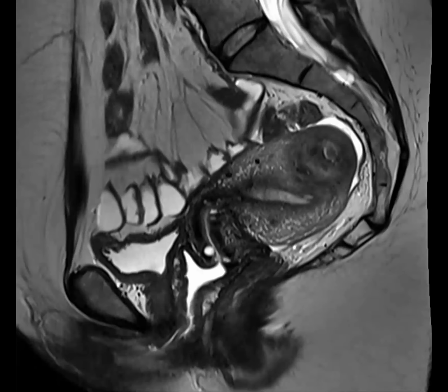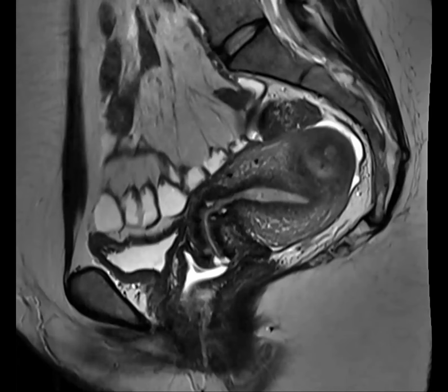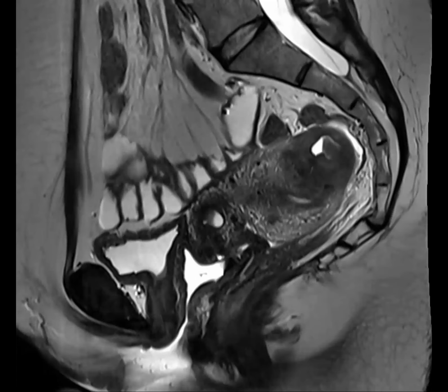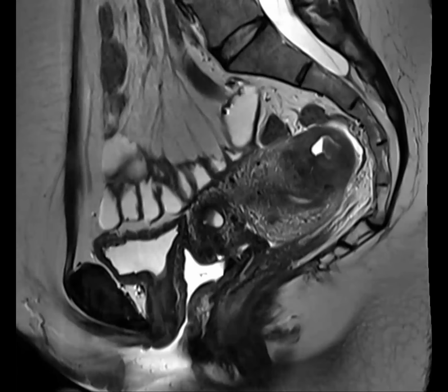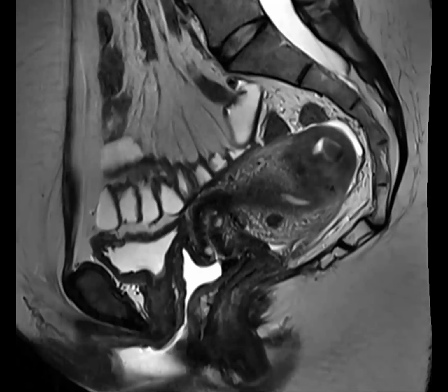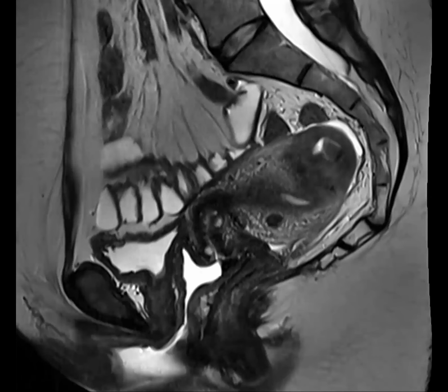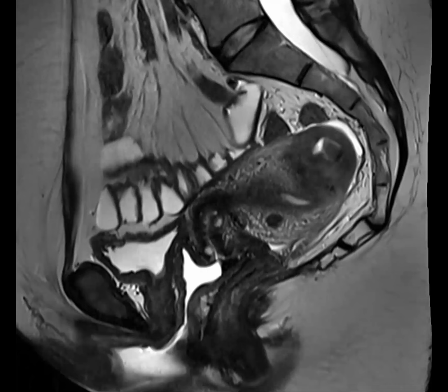The patient does have concomitant adenomyosis. There are small T2 hyperintense findings there. But it's different from adenomyosis because that is more diffuse. I guess you can have a focal adenomyoma, but they don't really have the cystic cavitation from the endometrium. And fibroids are more homogeneous and ball-like. You can have a degenerating fibroid with areas of hypoenhancement, but it's not rounded central cavitation. And this is thought to be a Müllerian abnormality, a genital thing. Got it. Yes.